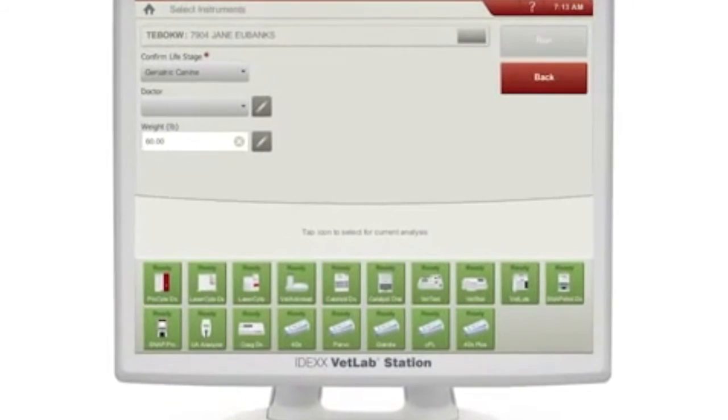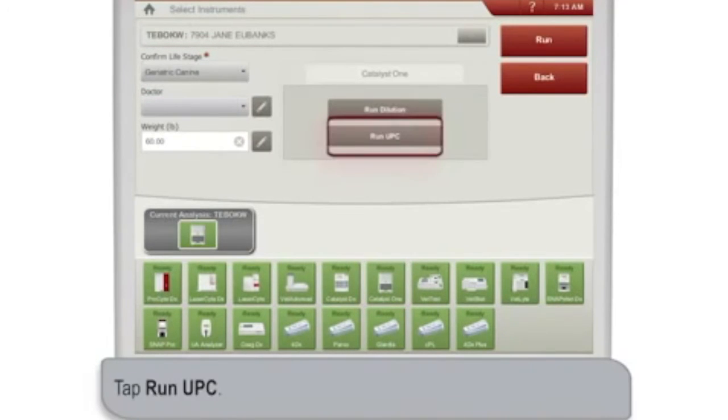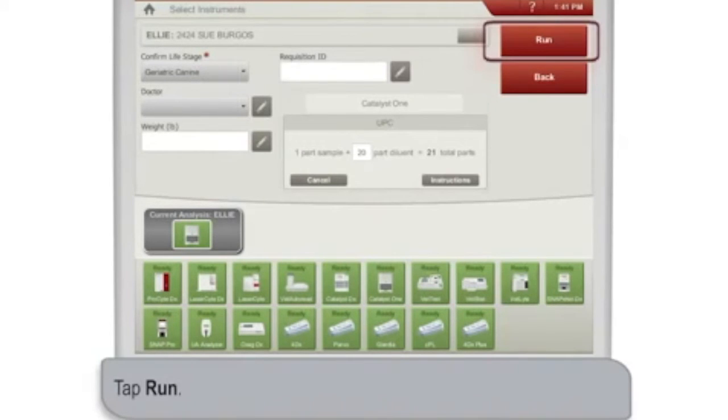On the IDEXX VetLab station, select the Instruments screen, confirm the patient's life stage, select the Catalyst 1 Analyzer icon, and then tap Run UPC. When you're done, tap Run.